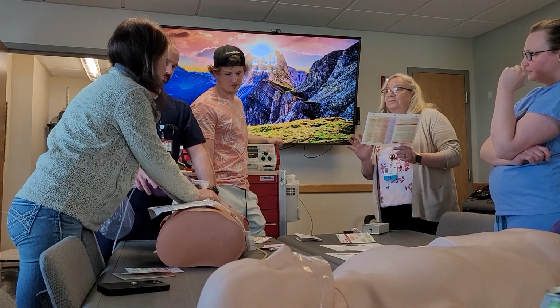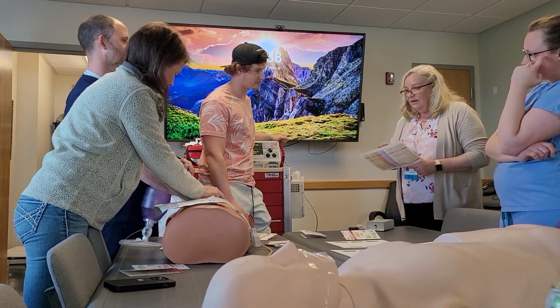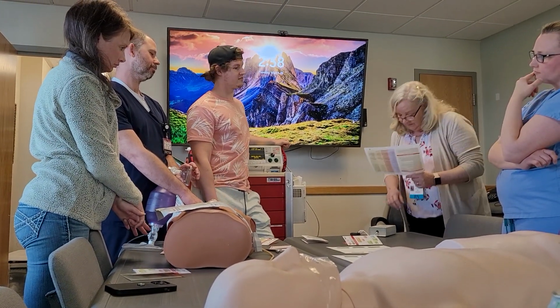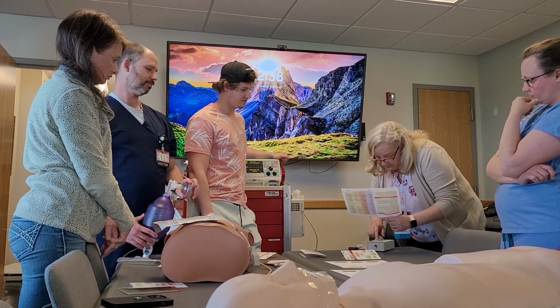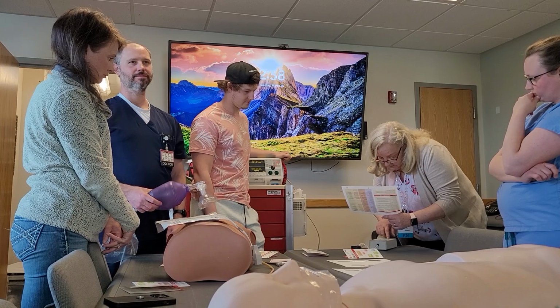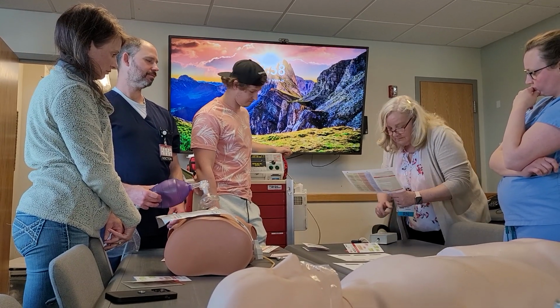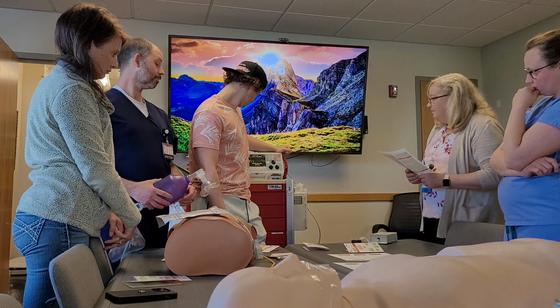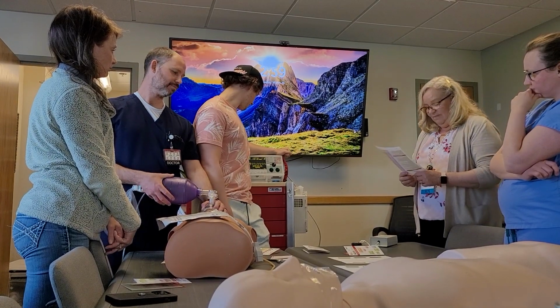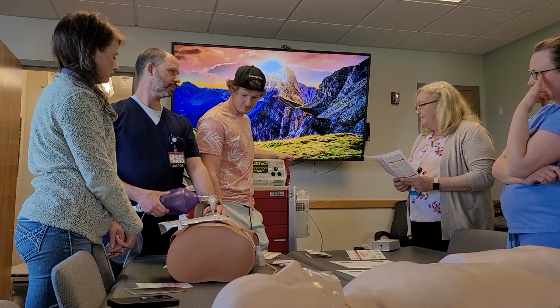Alright, well, what are you gonna do? See if there's a pulse. Check if there's a good pulse now. Right, so stop your CPR. Check for a pulse. And now we are at... Alright, wide complex, monomorphic VTAC, okay. We've got a pulse. No pulse.